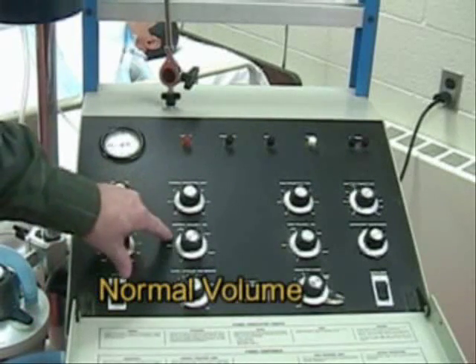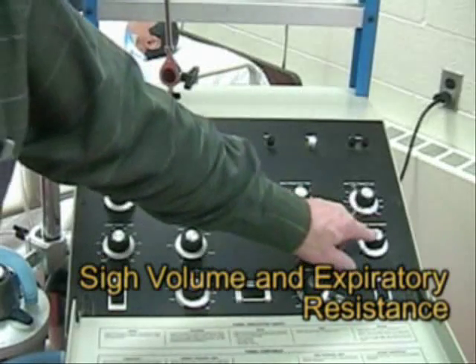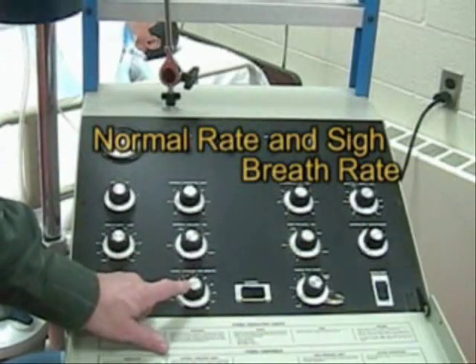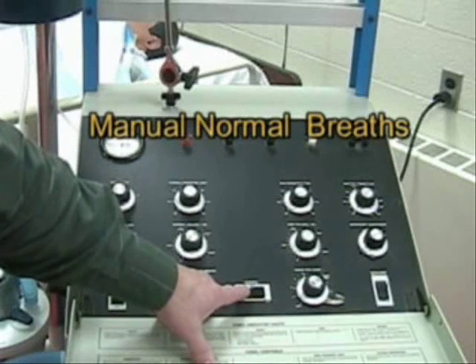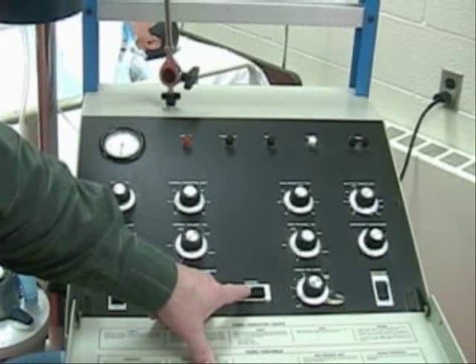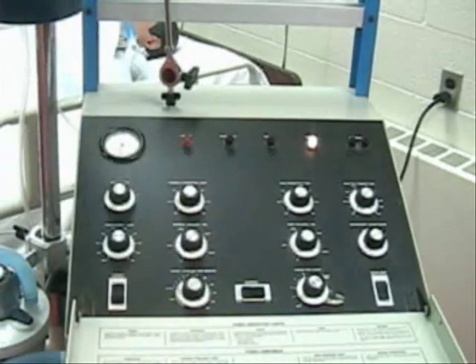Normal volume is our tidal volume. Then we have sigh volume, expiratory resistance, the rate in cycles per minute, and sigh breaths. We also have a normal breath button — we can give an extra breath in between the machine breaths. Or we can give a sigh breath, which is a larger breath.